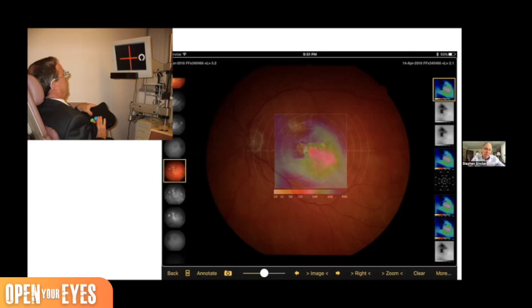So I've invented the OmniField, which measures Landolt Cs. So the patient responds by buttons or a joystick to the positioning of the Cs. But those Cs can be presented in mesopic illuminance environments and with contrast that mimic real world conditions. So we can test a patient under real world conditions.